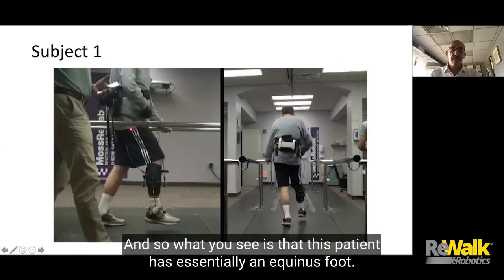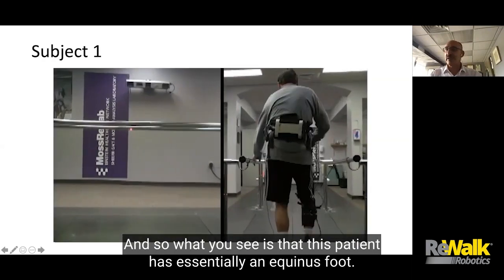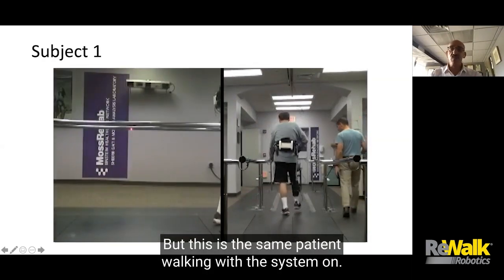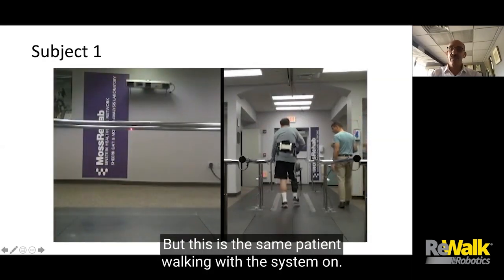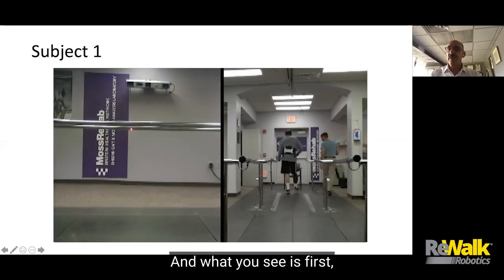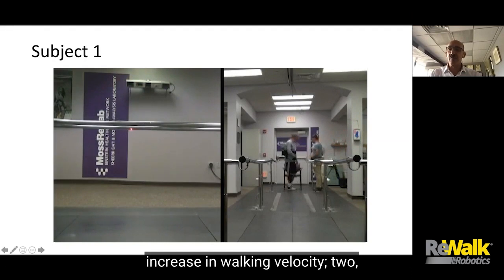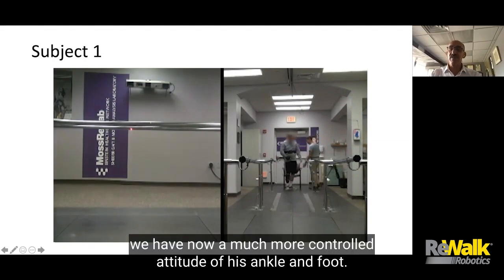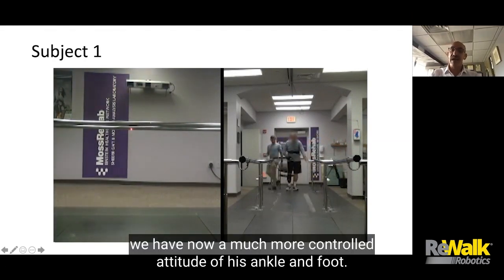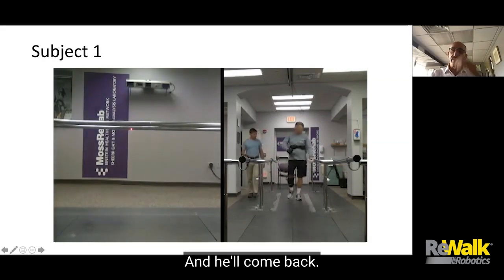What you see is that this patient has essentially an equinus foot. This is the same patient walking with the system on. And what you see is: first, an increase in walking velocity; second, we have now a much more controlled attitude of his ankle and foot.